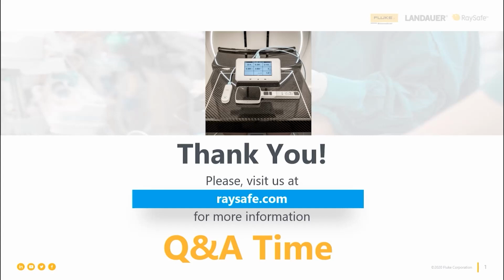These phantoms are huge and usually come in big suitcases. So if you're traveling with this phantom, it is not too uncommon that it stays in the car for hours. And the temperature in the car can either get very warm or very cold, depending on where in the world you are.